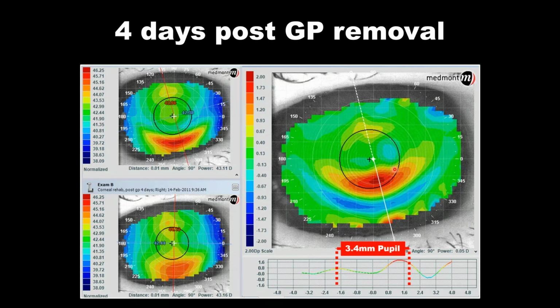And we're seeing what's happening within the pupil, how much the cornea is steepening down here over time as we allow that cornea to take on its normal shape. Because the GP isn't creating the molding, basically it was a really flat fitting lens that really shouldn't be deemed acceptable for that eye. And so this patient was clearly somebody who needed a refit. But you can tell from the subtraction how much change is going on over time between just these two visits, 4 days apart. There's a massive amount of shift.